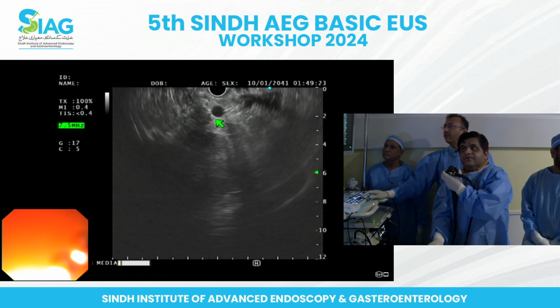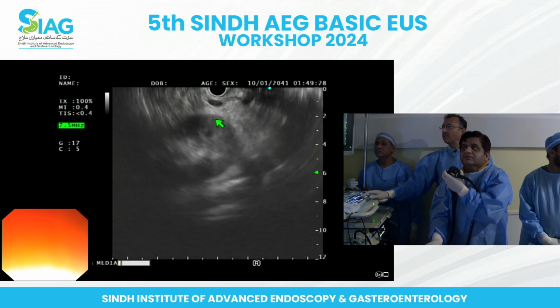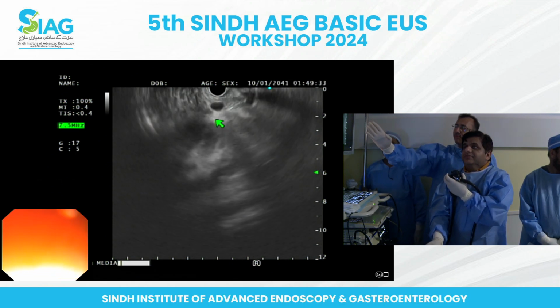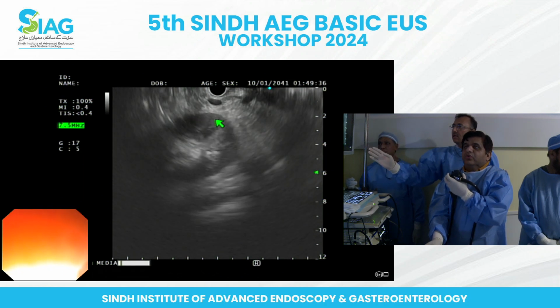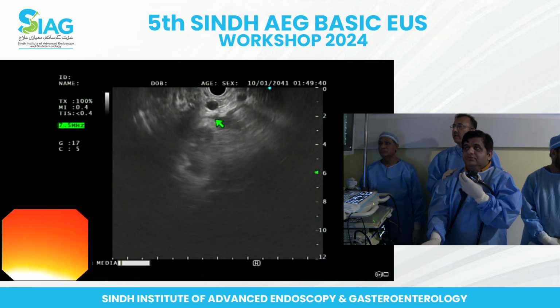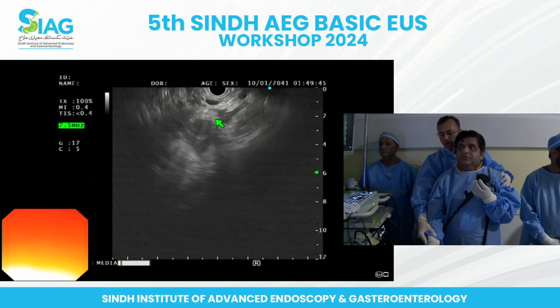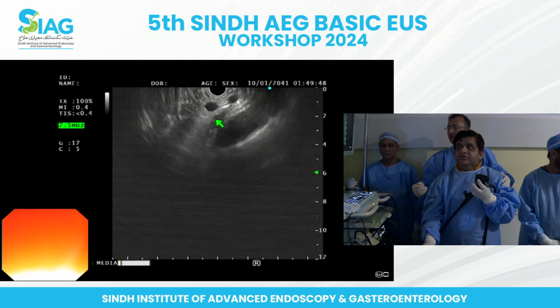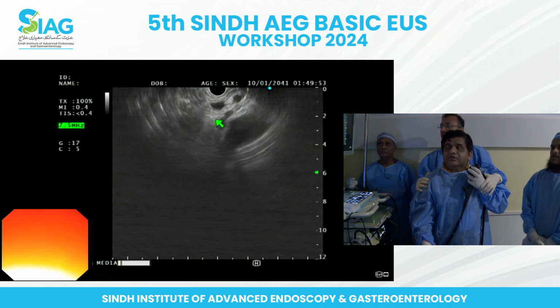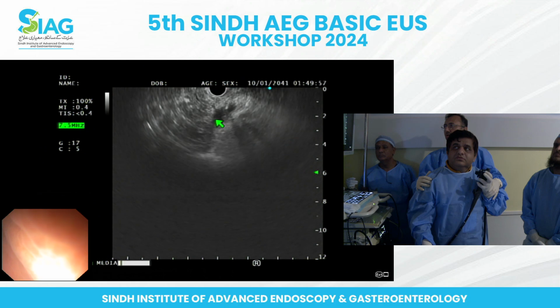Okay, now from this point, go back to the previous neutral position, the point from where you had started going towards the tail. So go back to the initial point, when you started to rotate clockwise. So go back, anticlockwise, not with the rotation of your fingers, rather with the rotation of your shoulders and your body. Okay, right. Now you go here.